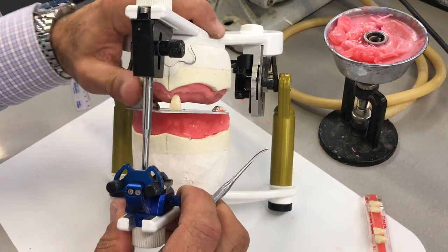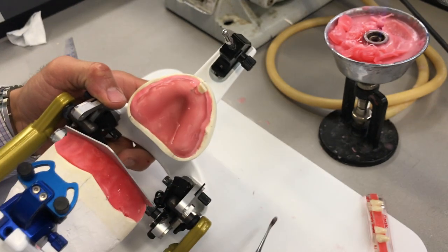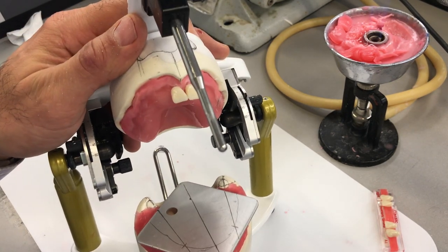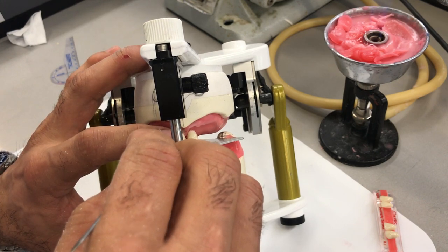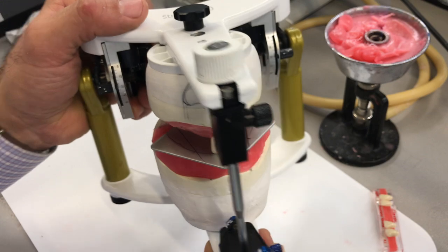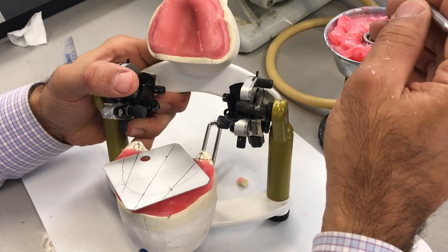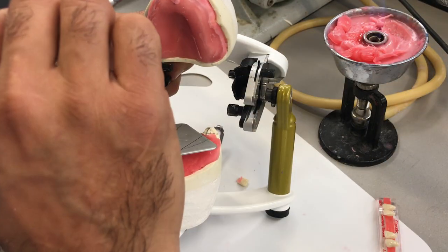Same thing like the other side. I'm going to place a little bit of wax here and place the tooth in position in relation to the other tooth so they match each other. And hopefully when I close the articulator, the contact between those two teeth is over the midline. That's why we like to set up the two centrals first, to ensure that these two teeth match the midline according to our maxillomandibular relations.